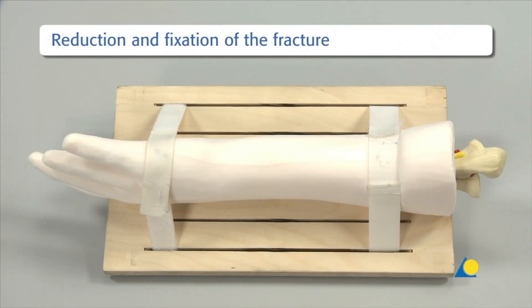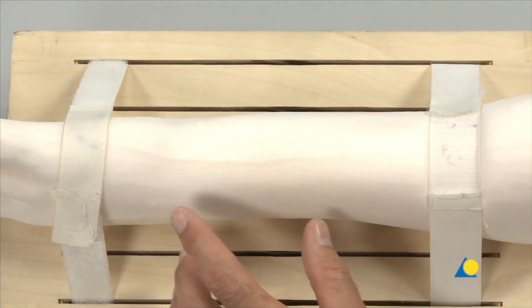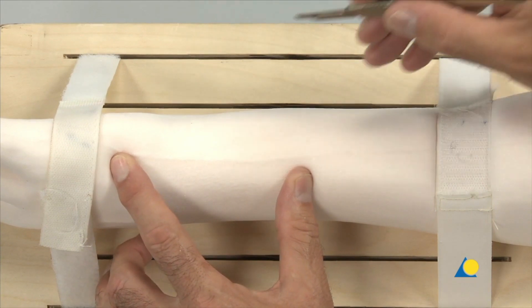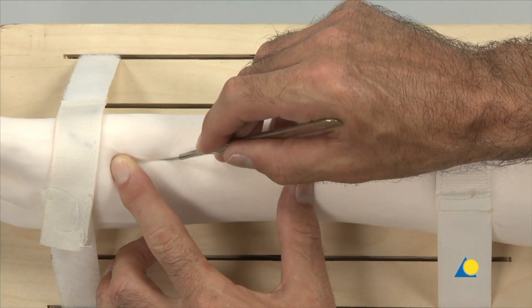For this exercise the bone model is secured in position. The ulna styloid and shaft are palpated to plan the incision. A straight incision is made along the length of the distal ulna.